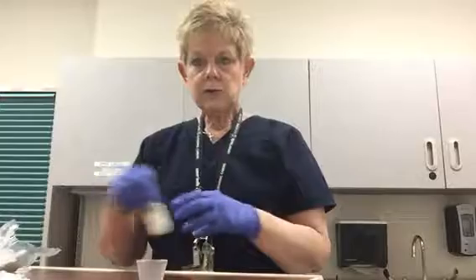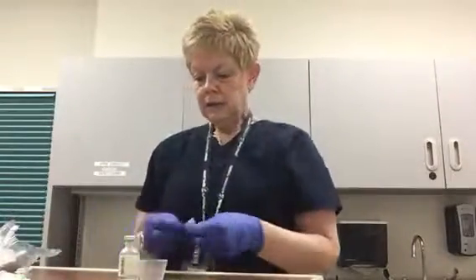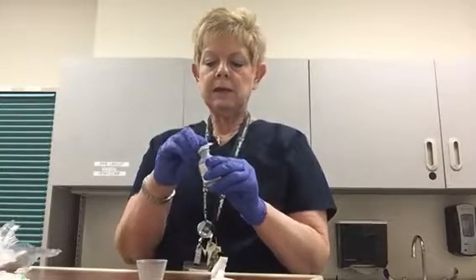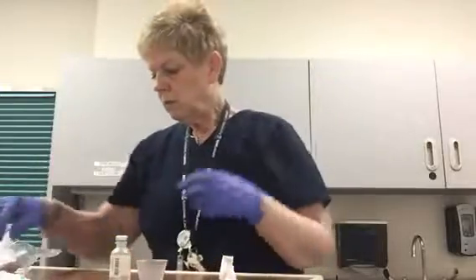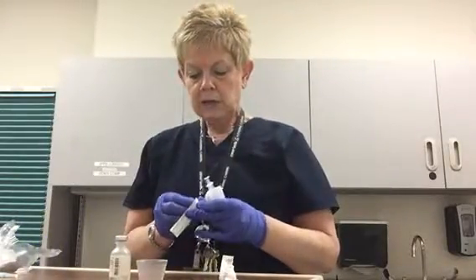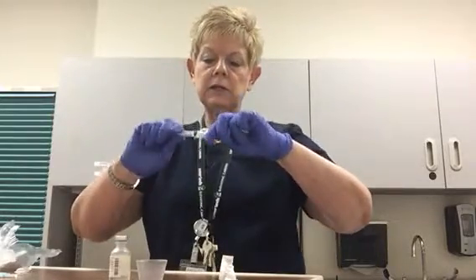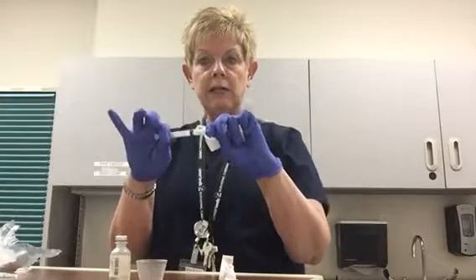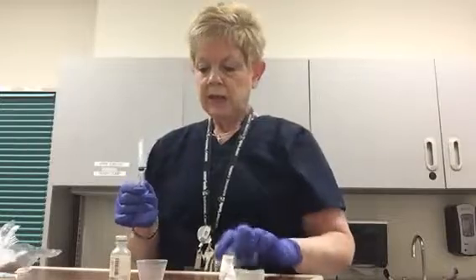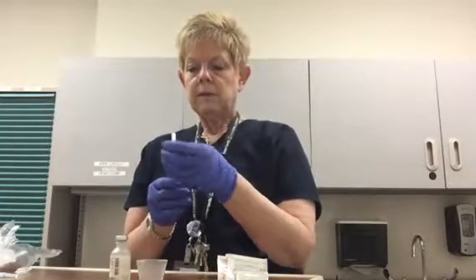Our next demonstration is going to be drawing up through a multi-dose vial. Here again, we've checked our label to make sure we're using the correct medication. We're going to take an alcohol wipe and wipe off the top of the bottle. Now I'm going to prepare my syringe — I'm going to draw up two milliliters of solution from this vial today. This is a three milliliter syringe. As you apply the needle, this is a luer lock needle, so make sure you screw the needle down until it won't go any further — it needs to be on there snugly. If you fail to do that, you'll get air bubbles as you're trying to pull up your medication.